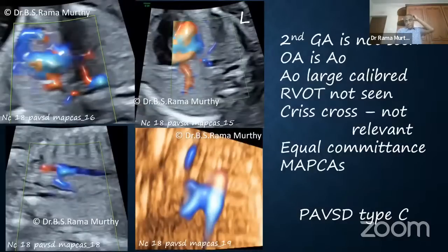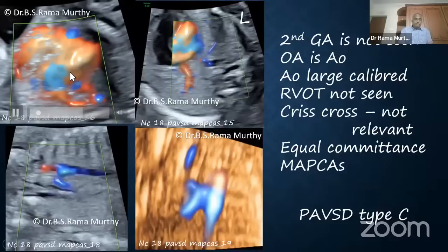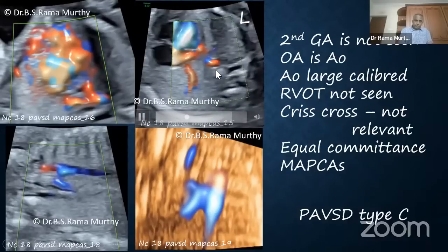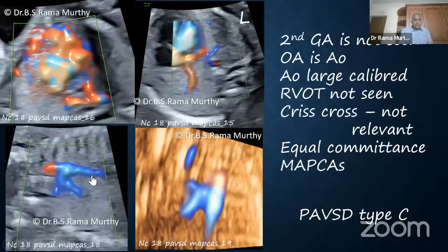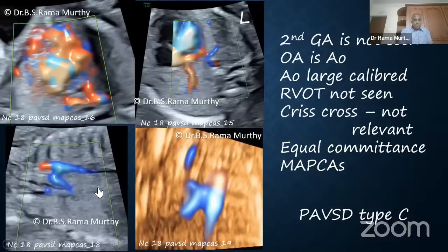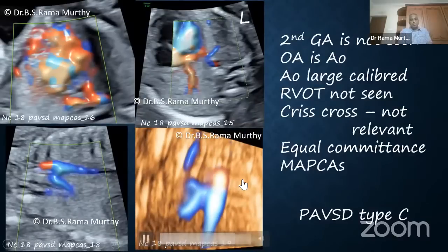This is type C, rather, where you have direct branches from the descending aorta going into the lung, right? Major aortopulmonary collateral arteries, MAPCAs. That is one MAPCA here. Here is another MAPCA, that's the descending aorta, and from the descending aorta, you have an arterial branch which is going into the lung. And this is a little bit of 3D, color 3D with glass body, showing you the MAPCAs in 3D.